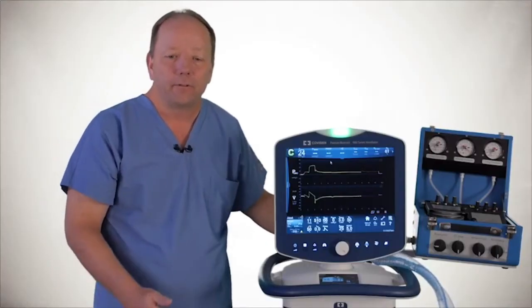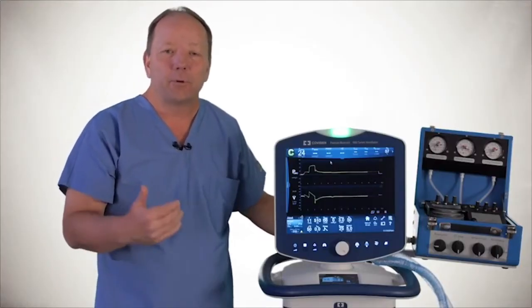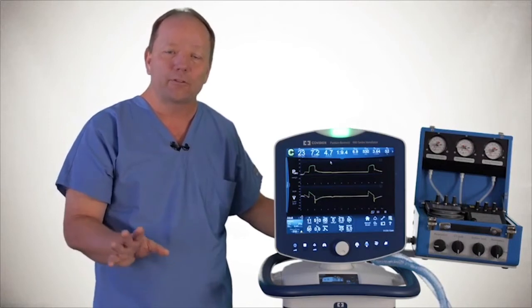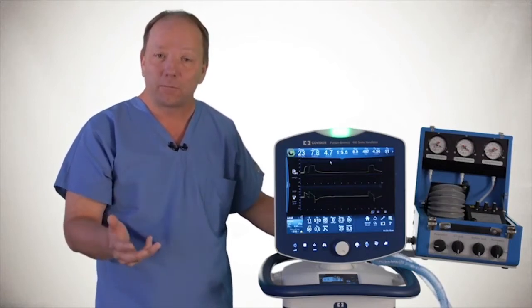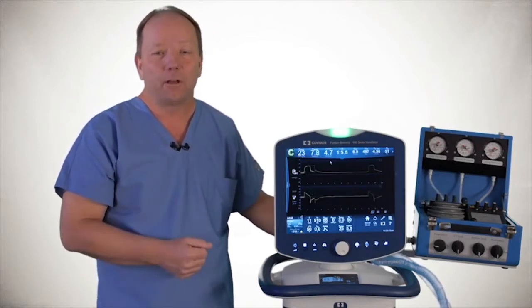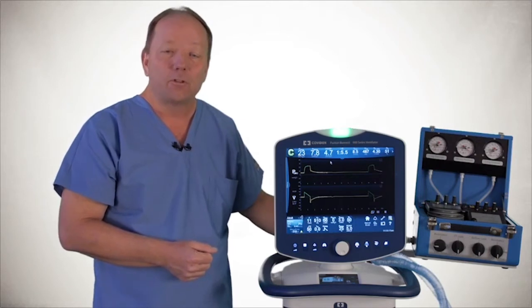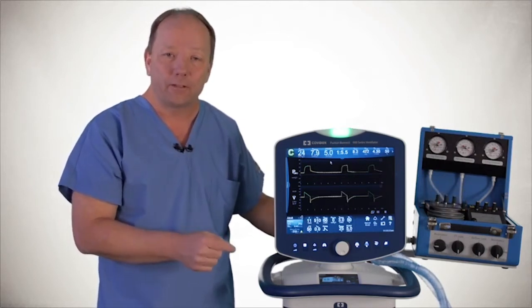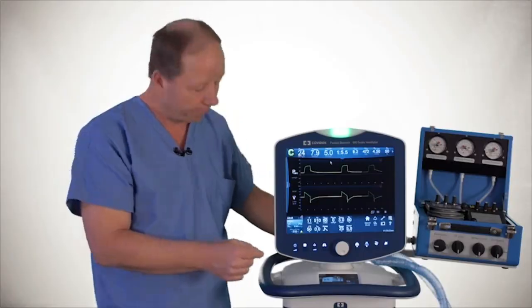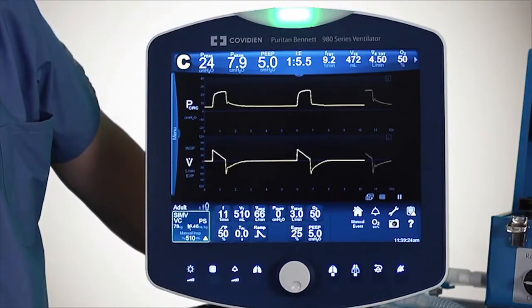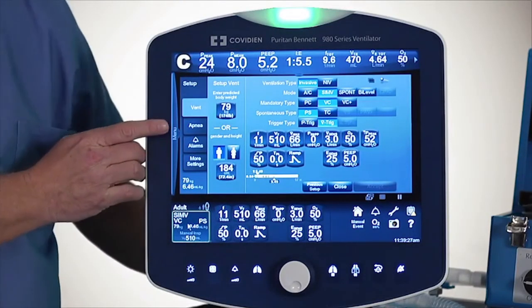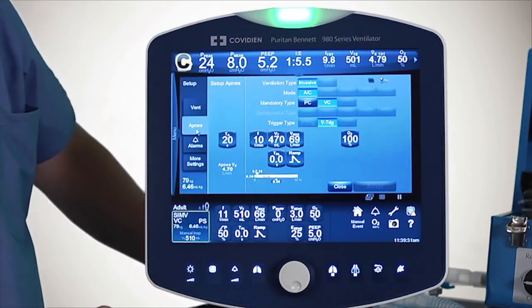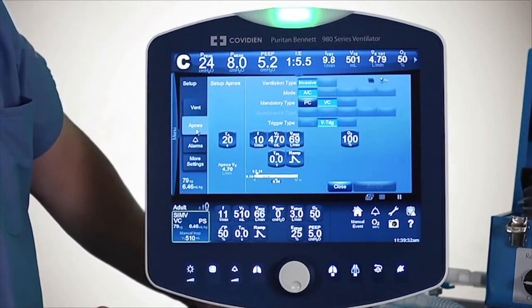Now let's talk about the next component: setting the apnea settings. We talked about initial ventilator settings and alarms, but another key part is the apnea settings. To access the apnea settings, I'm going to go under the vent setup button on the lower left-hand side. Right here are my apnea settings, so I'm going to touch apnea settings.